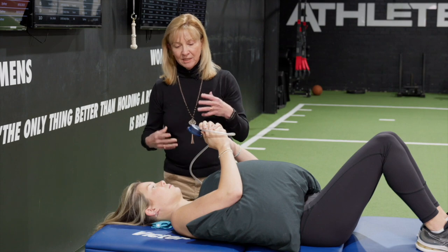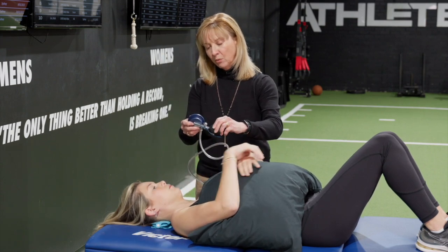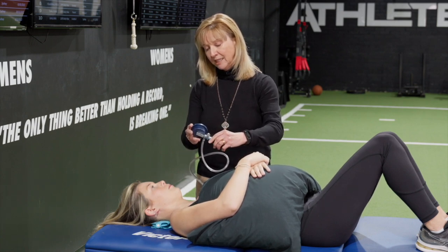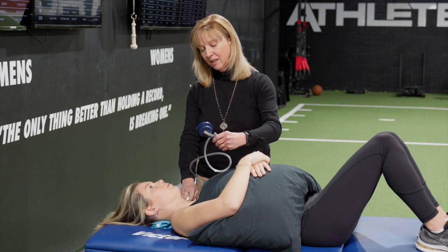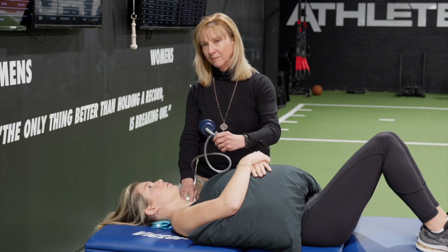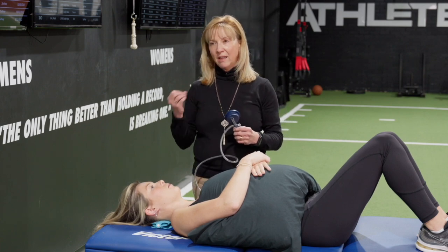So they can position themselves and practice that. The other thing they can do is we can actually turn the dial away, and now I want you to try and go just to 26 — nod and hold. That's too much, and relax. That's it, good, and relax. Nod and hold, and then you show them where they're at, and then take it away. So they get to know what 26 feels like.